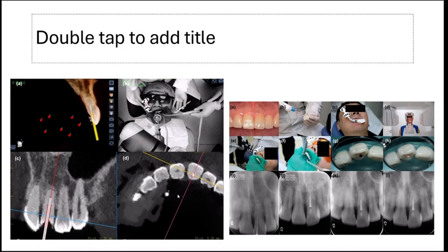Seven reference markers were selected and calibrated to link CBCT data with the robotic arm, and the path of entry was digitally planned from the dentino-enamel junction through to 14 mm apical to the incisal edge, ensuring straight-line access into the pulp space. 3D visualization allows the clinician to monitor in real time.